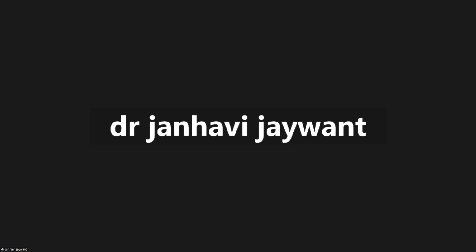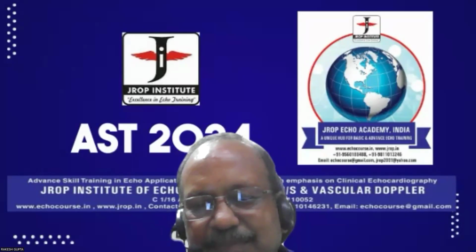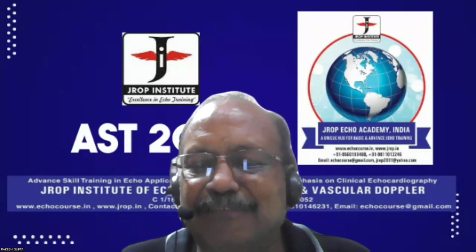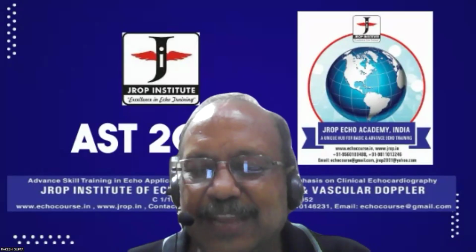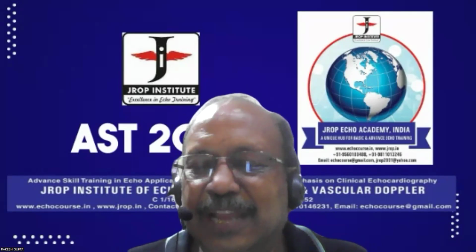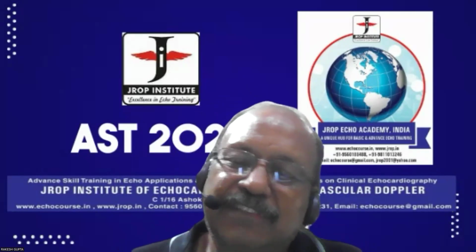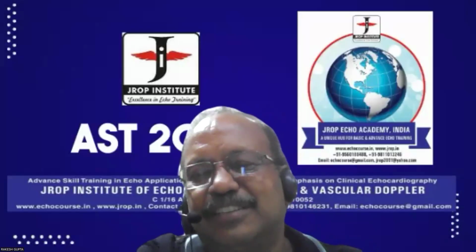Yes. As soon as I see rupture of sinus of Valsalva or rupture of papillary muscles, I don't do anything. Immediate send for surgery. Because when I can see that the mitral valve is prolapsing back all the way into the LA, and we see a ruptured papillary muscle or ruptured cords, then I know we are dealing with a severe mitral regurgitation. If I see a vegetation, obviously I don't do anything. Send for surgery.